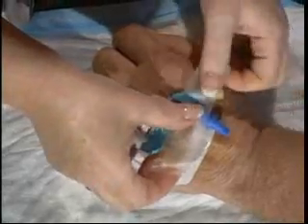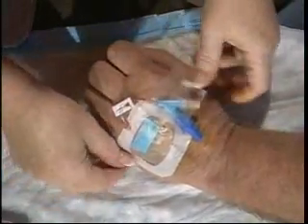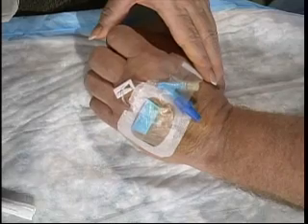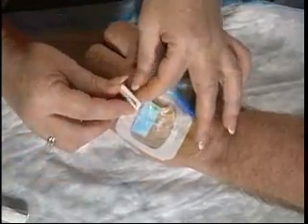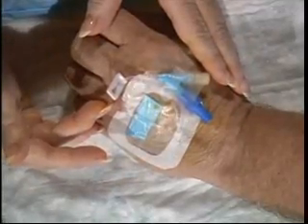These are sterile tapes. They were in the kit, and that's what they're supplied for, for you to use to secure the device to the hand. This way, the patient now can move around without fear of losing the device or catching it on the bedclothes or clothing. The other aspect you should do, provided by this particular manufacturer, is use a slide clamp. This helps prevent any reflux of blood products back into the catheter itself.